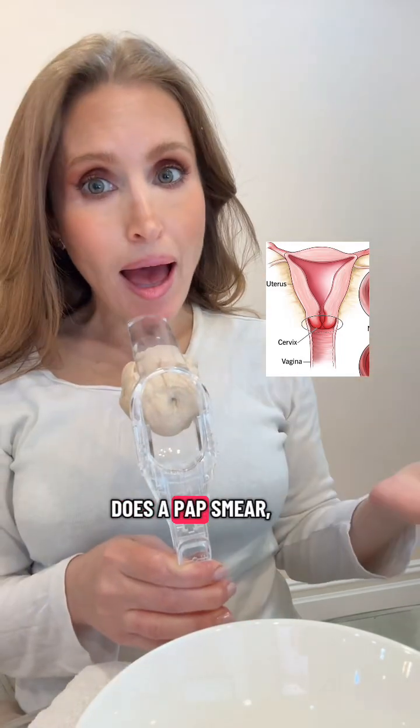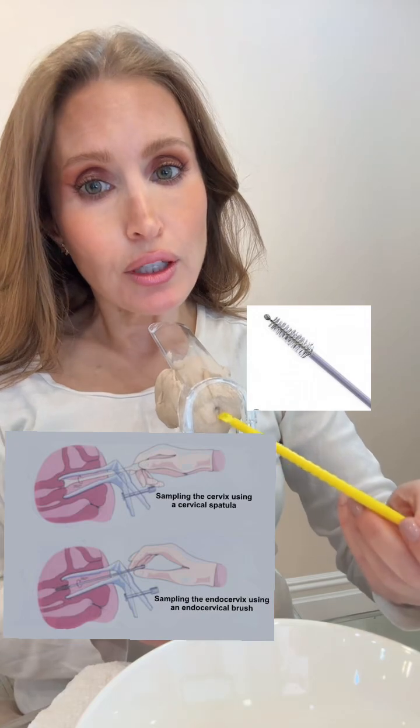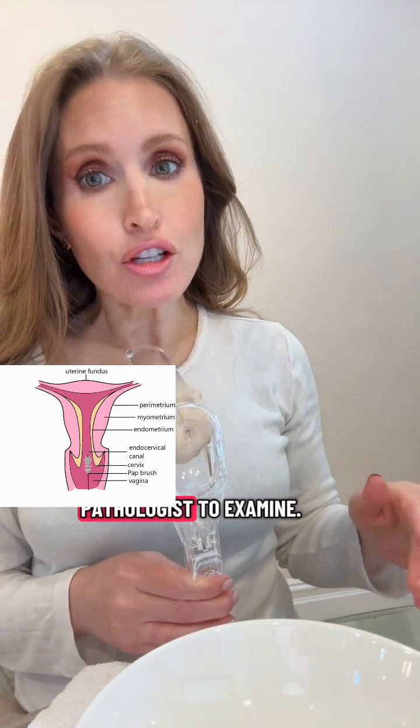When your doctor does a Pap smear, they take a spatula and they sample around your cervix. Also something called a cytobrush, which is used to collect cells from inside of the cervical canal. They'll do a slight scraping. That sample is sent off to the pathologist to examine.